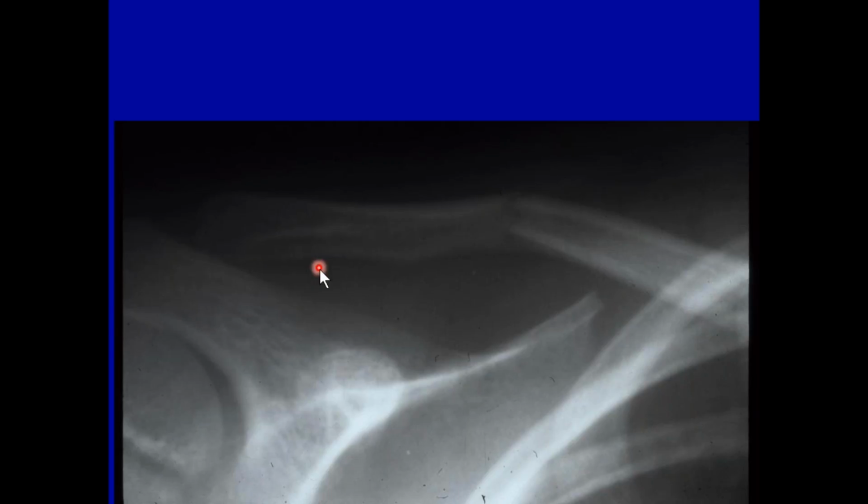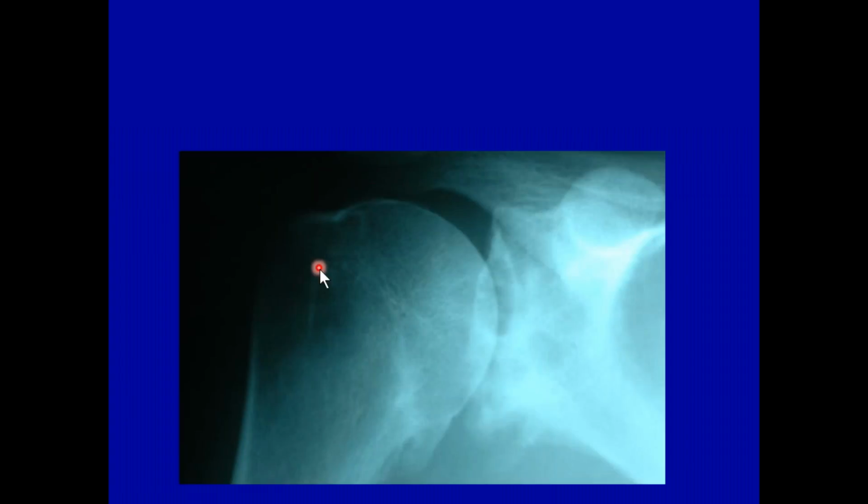So that's how patients, and we love them to bits, because if we didn't have patients, we wouldn't have job security, but that's how they injure themselves, and that's where you're called in to take an appropriate x-ray, and we would like you to have it well done or be able to perform it so that it's highly diagnostic. Even though when it's positioned poorly, I can tell that there's been previous injury to the humeral head.